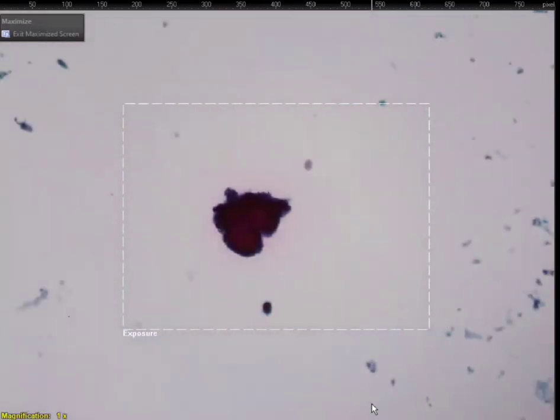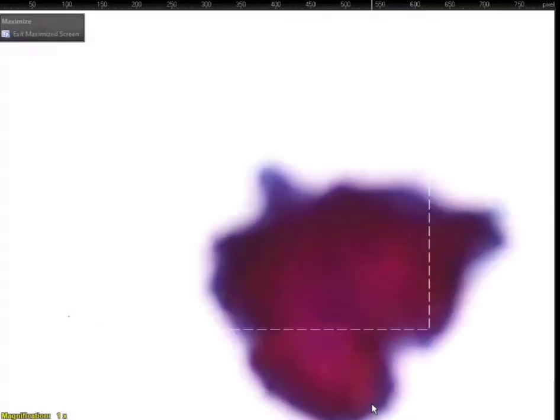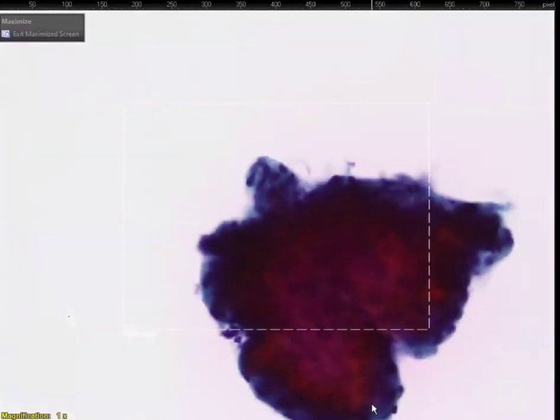Okay, so we have a large chunk of something.